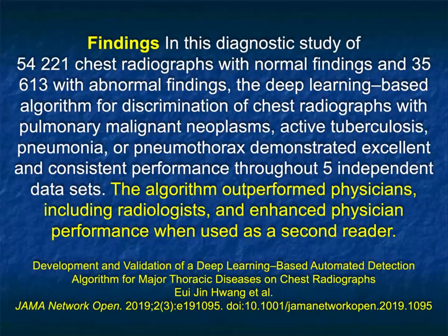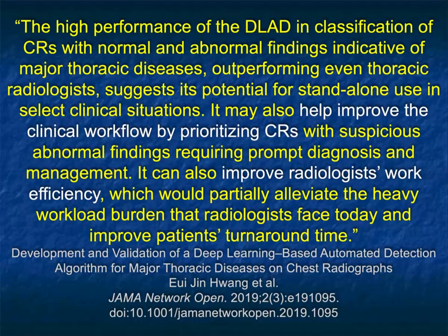I would guess that chest x-rays have less issues than CT. It's probably a little easier to make it work well, regardless of the institution. So again, very, very important. And the article makes the point that doing so well will make it an excellent second reader to help the radiologist. The high performance of the program in classification of chest x-rays with normal and abnormal findings, indicative of major thoracic diseases, outperforming even thoracic radiologists, suggests its potential for standalone use in select clinical situations.